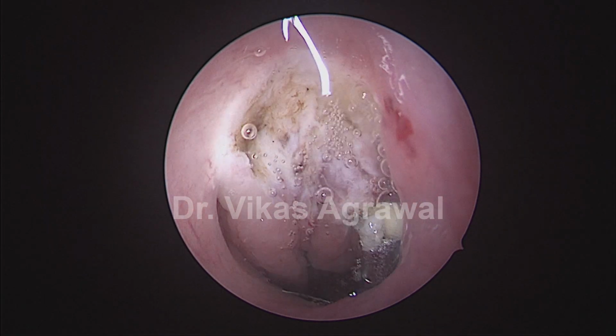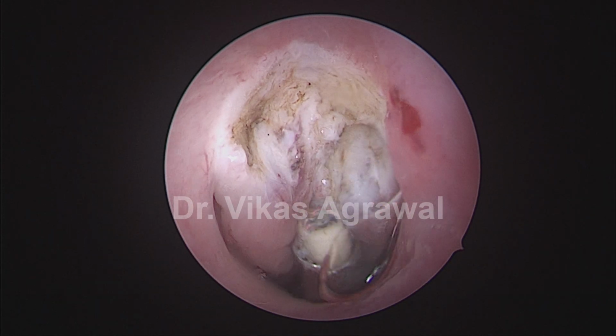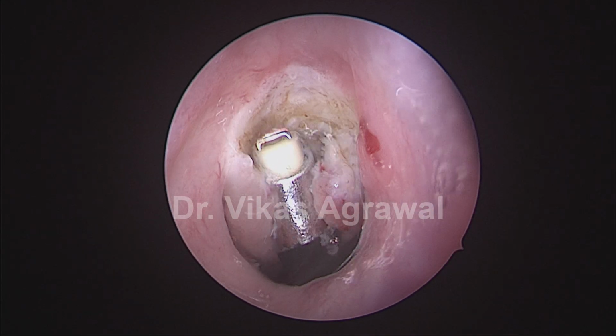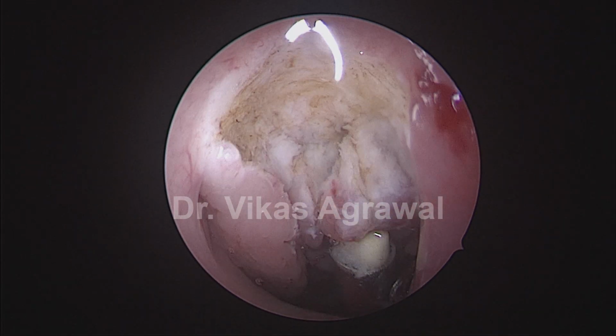Now I'm debulking the adenoid tissues layer by layer so that I can define the whole superior boundary, which is the periosteum below the sphenoid bone.